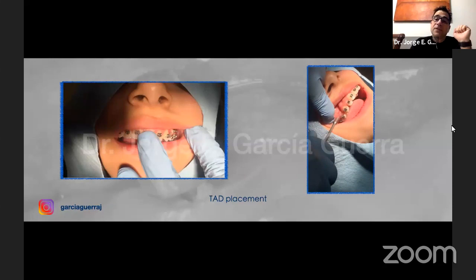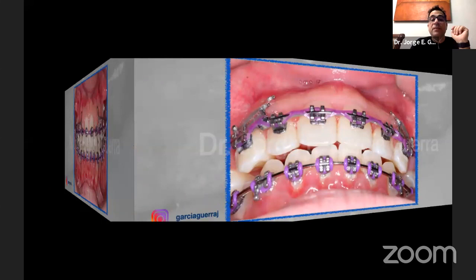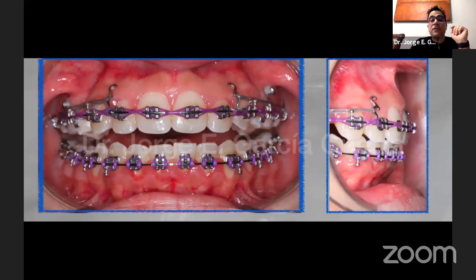Okay, let's go to the next picture. And this is some months later. We stopped using the mini implants for the retraction. We're only finishing to close the space. Now we have a good overbite, a good overjet. And now we're gonna just finish the details of this patient.